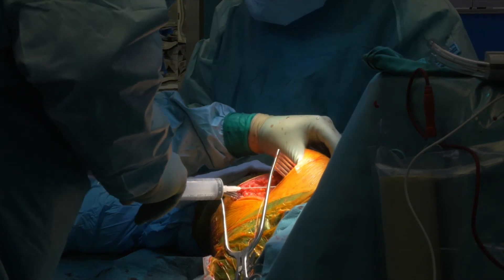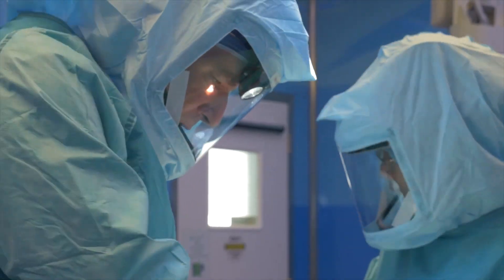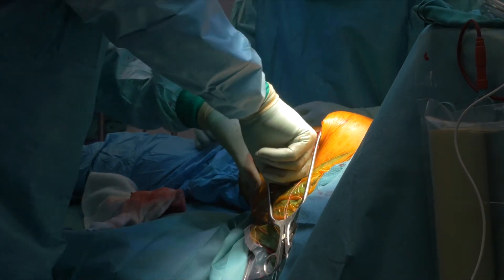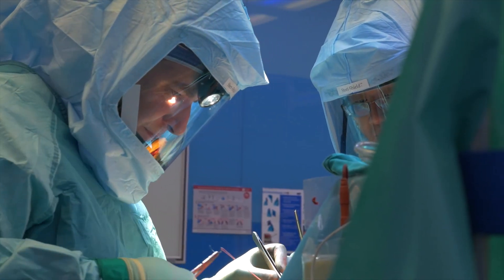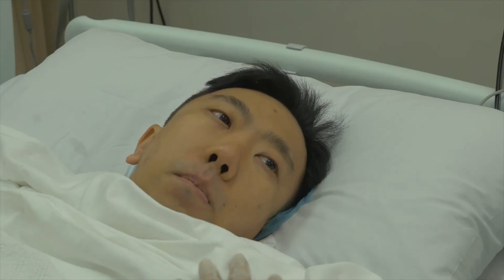Before closing the joint, more medications are injected into the joint to reduce post-op bleeding, and an antibiotic sponge is also inserted deep into the wound to reduce the chance of infection. Finally, the hip joint is closed up and the patient is allowed to wake from the general anesthetic in the recovery suite.